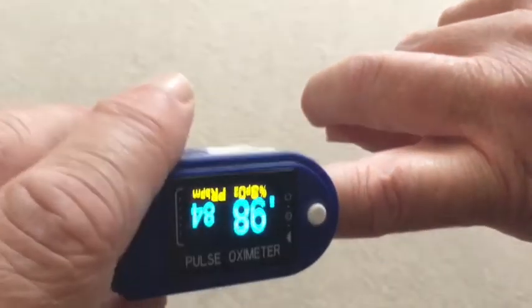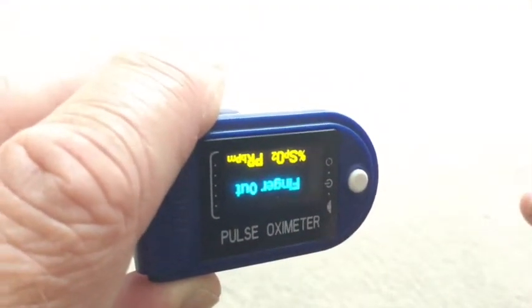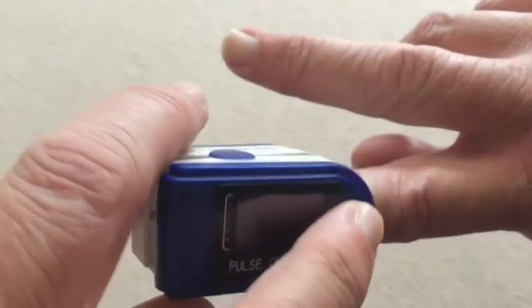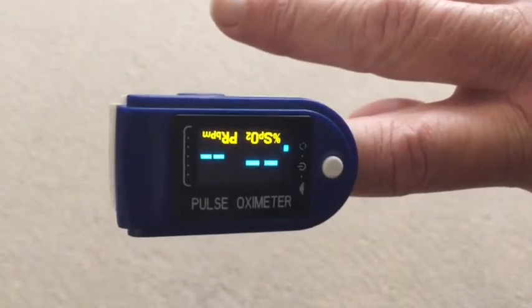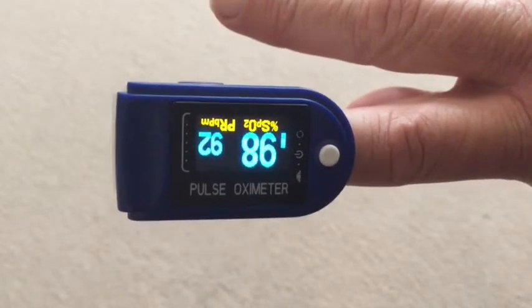One good feature is that it has a memory. Here you can see I selected the screen facing away from me. I take my finger out, allow it to turn itself off, put my finger back in again, and you can see that it starts on the same screen. It's just calculating the figures.